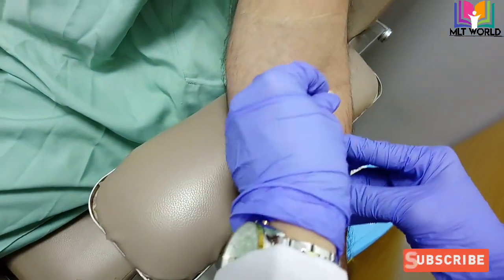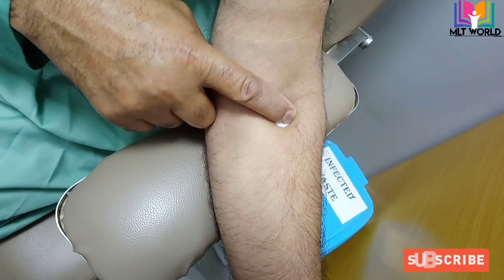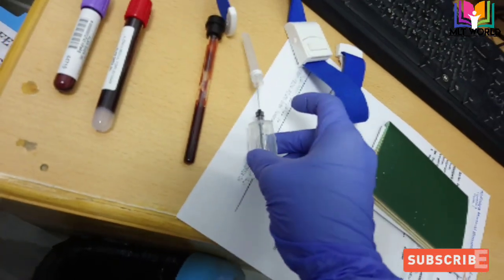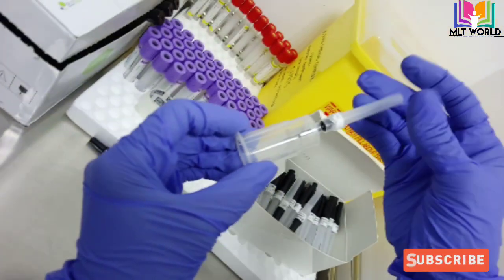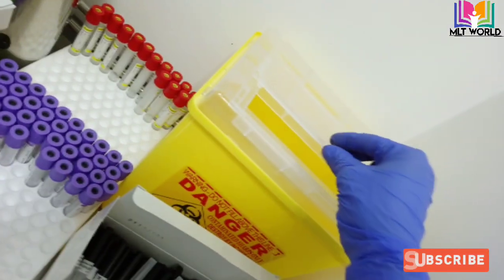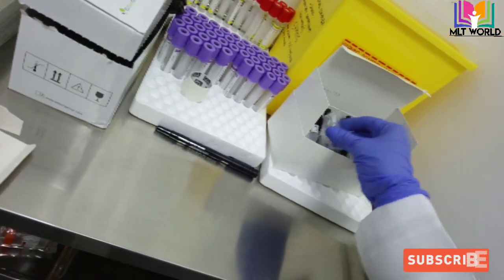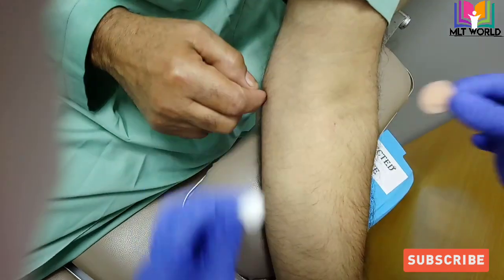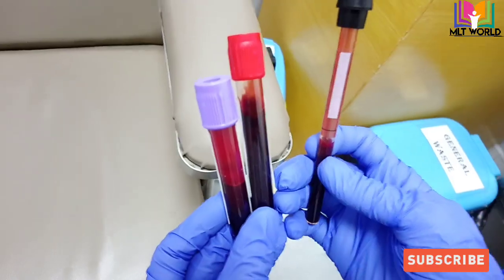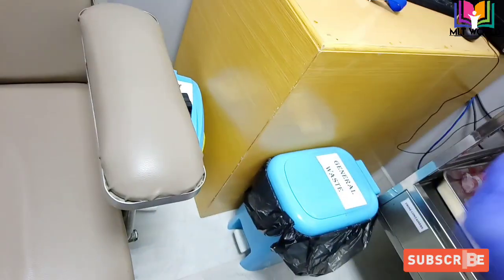When the last tube is nearly complete or complete, open the tourniquet, remove the sample tube, place the cotton, and carefully remove the vacutainer needle. With one hand only, put the cover back on the needle, then remove the needle anti-clockwise and discard it in the sharp container. The holder can be kept in the box for reuse, but the needle must be one-time use only. Remove the cotton, put the spot bandage, and discard the cotton in an infected waste bin.